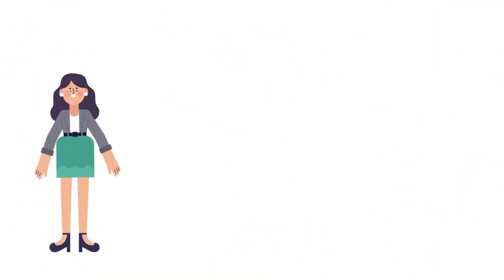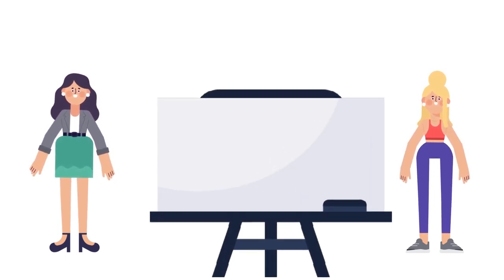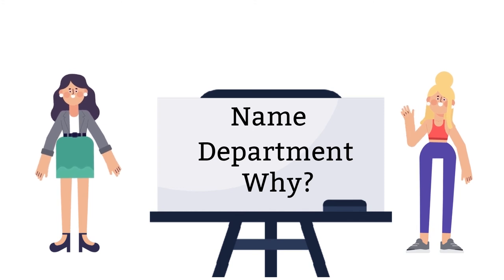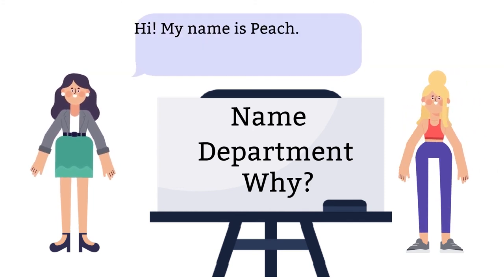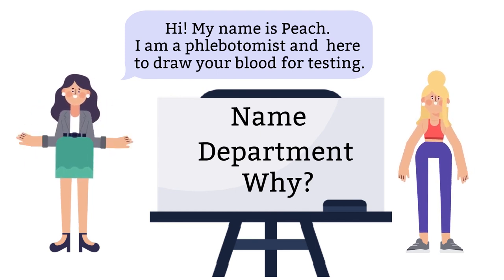Before you can perform a procedure on patients, regardless of what it is, you'll have to identify yourself: tell the patient who you are, what department you are from, and the reasons you are there. For instance, my name is Peach, I'm a phlebotomist, and I'm here to draw your blood for testing.